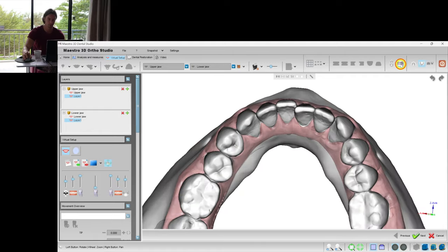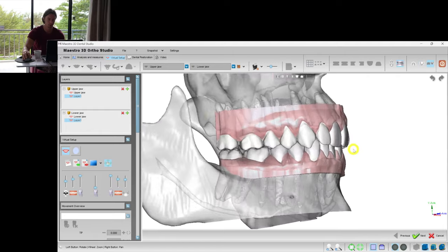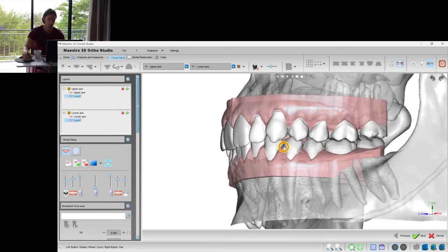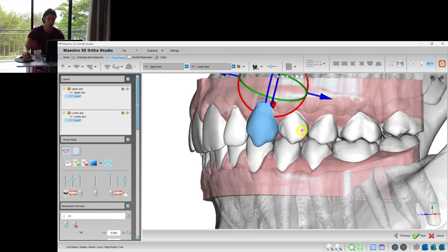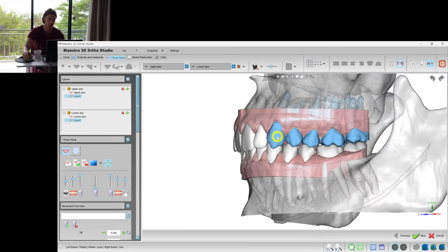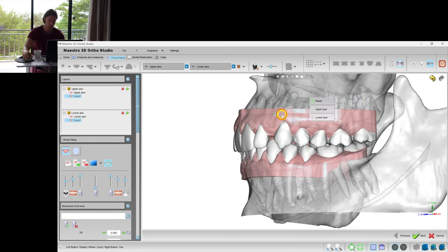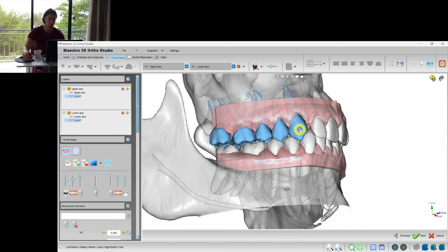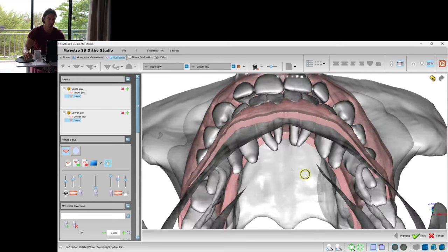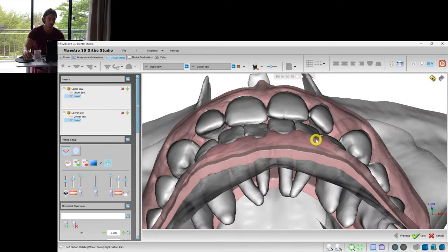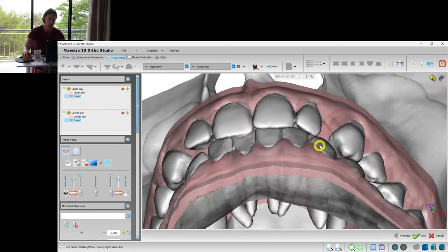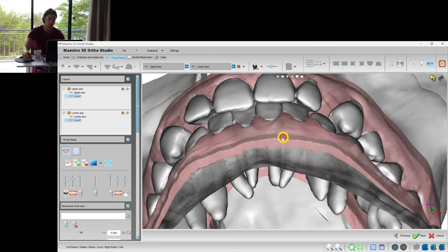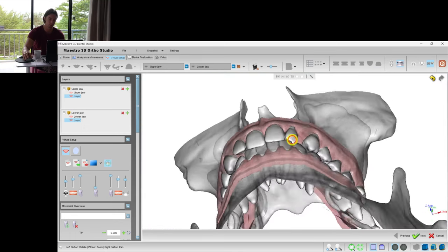Here we see that the canines are in class 2 relationships. What happens if we make the class 1? We see that we have too much space in the frontal area which cannot be closed orthodontically by just moving the teeth to those positions.